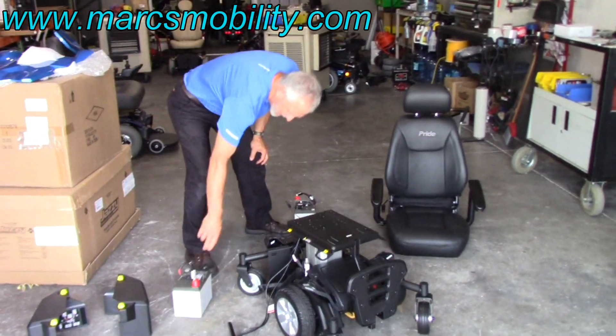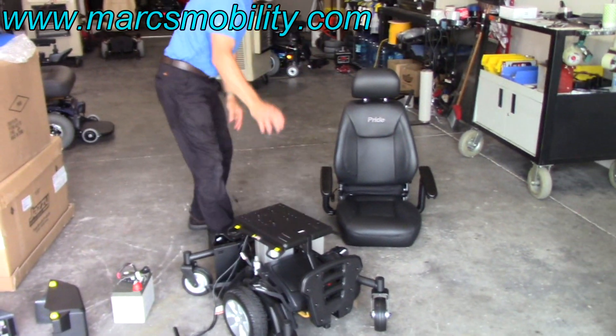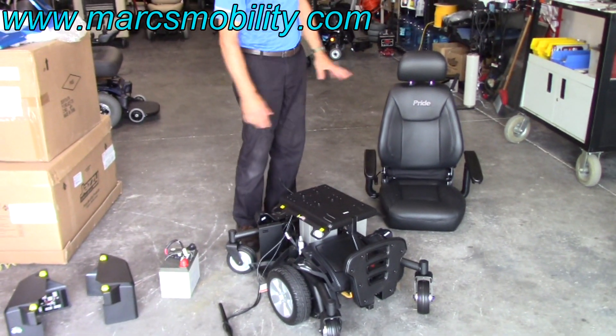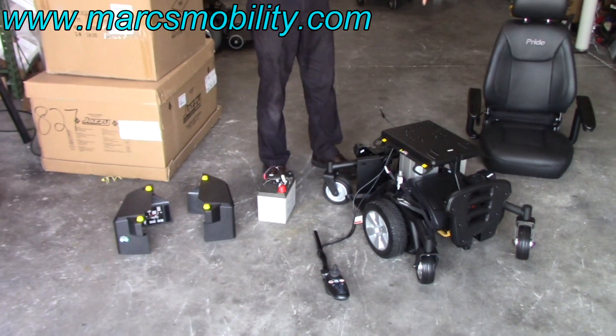Alright, so the chair that you have now is in four pieces. You've got the seat and the base, the seat, the two battery covers, and the two batteries.